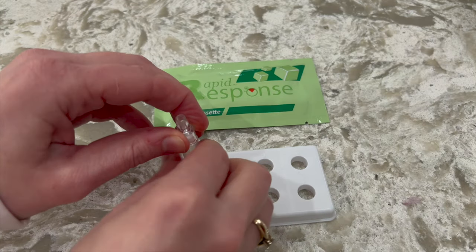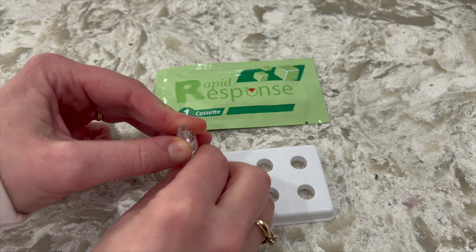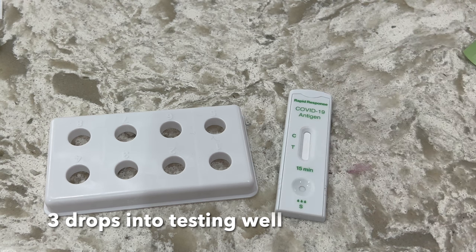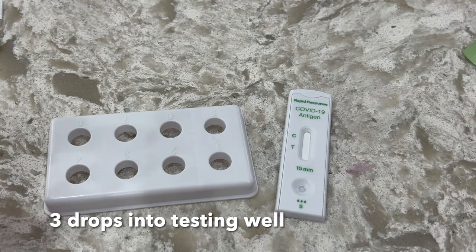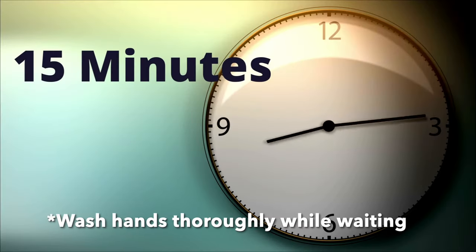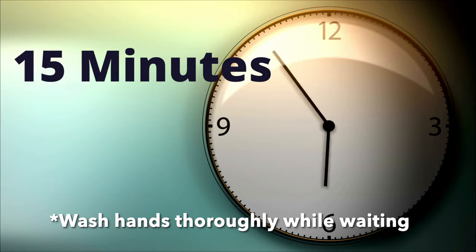Attach the nozzle to the sample extraction tube. Invert the tube and add three drops of the extracted solution into the sample well of the test device by gently squeezing the tube. Start the timer for 15 minutes and wait for colored lines to appear. Read the results at the 15 minute mark.